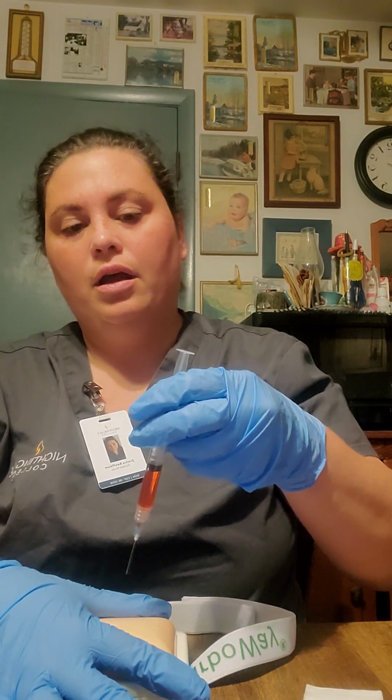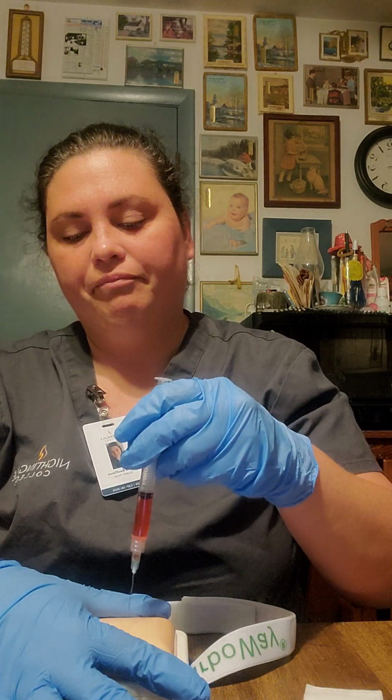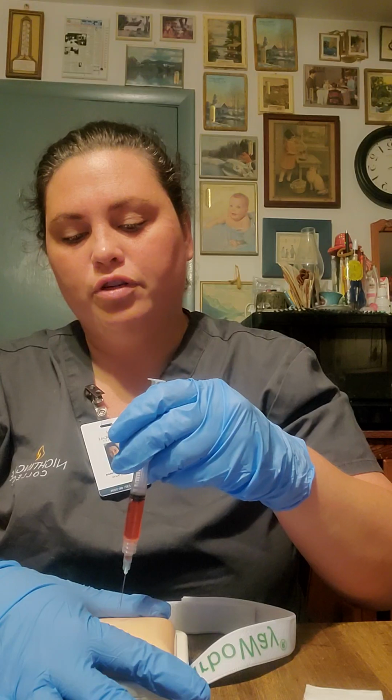I'm going to dart right in the middle, doing a 90 degree dart motion, straight in. Alright, and I'm going to use my other two fingers to stabilize, and on my non-dominant hand, I'm going to slowly inject my 1.5 mLs of morphine.